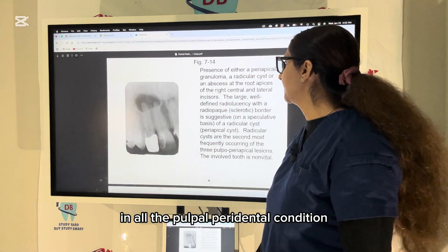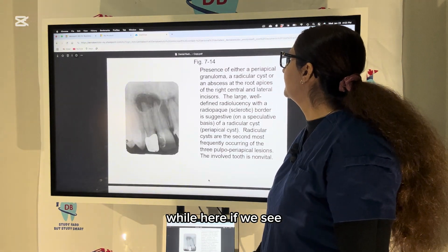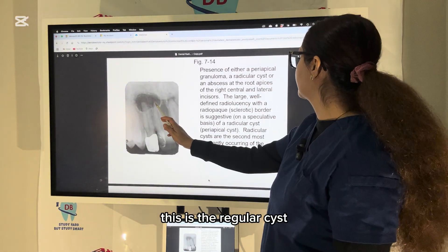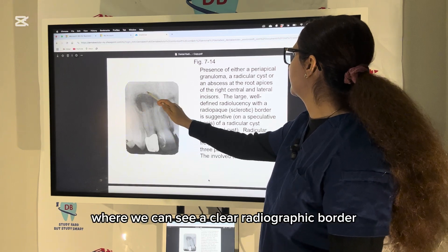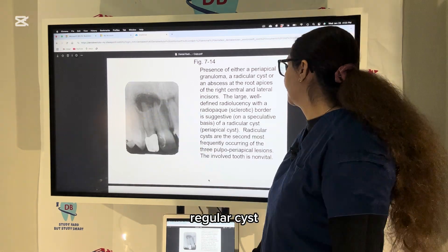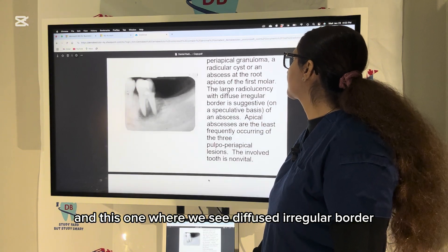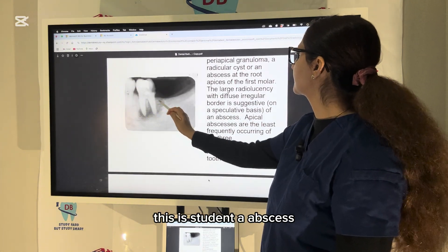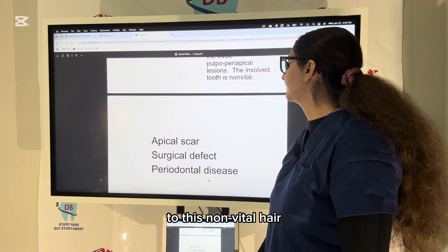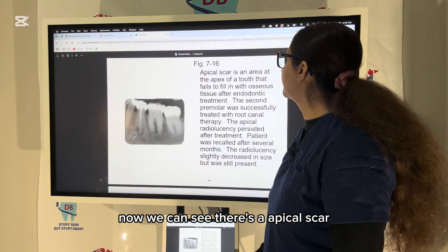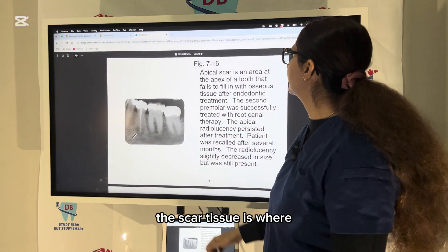Here, if we see a radicular cyst, there is a clear radiopaque border. And this one where we see a diffuse, irregular border — this is an abscess; the tooth is non-vital.